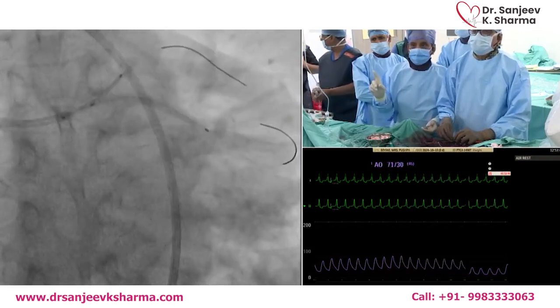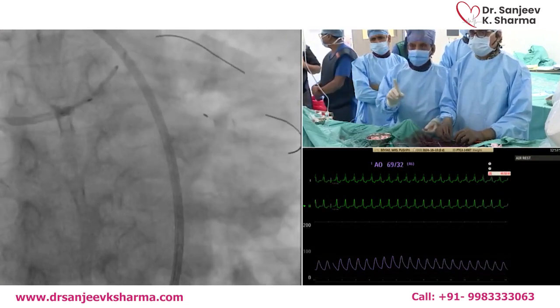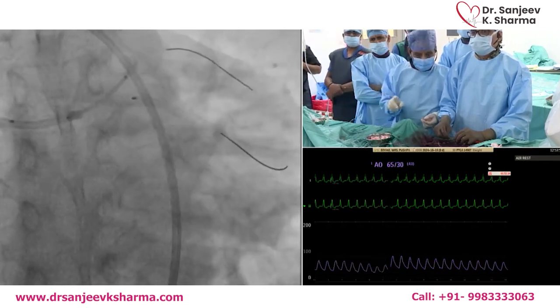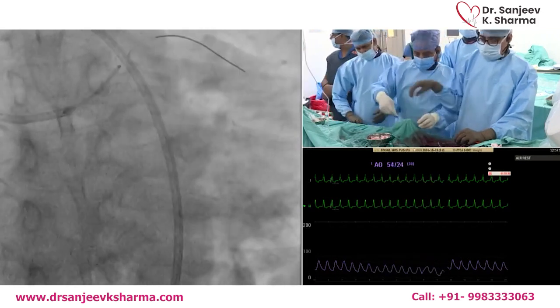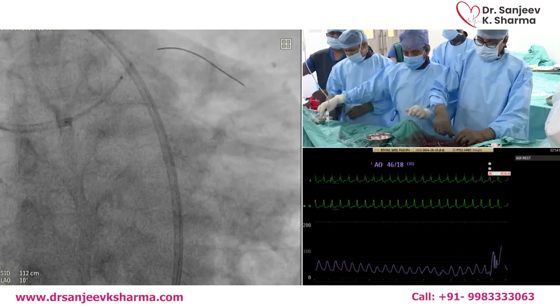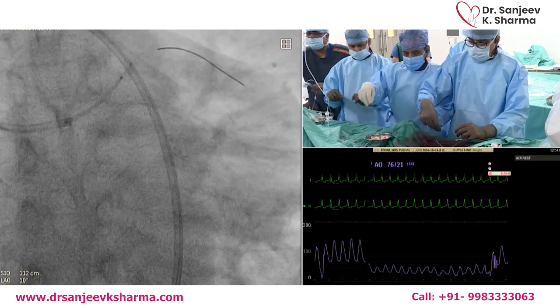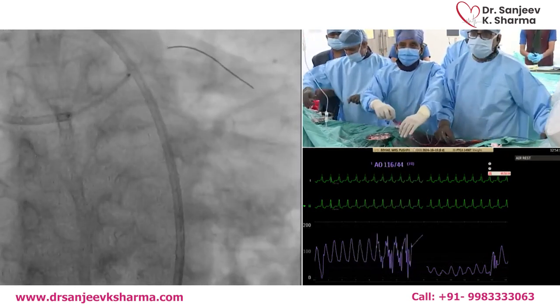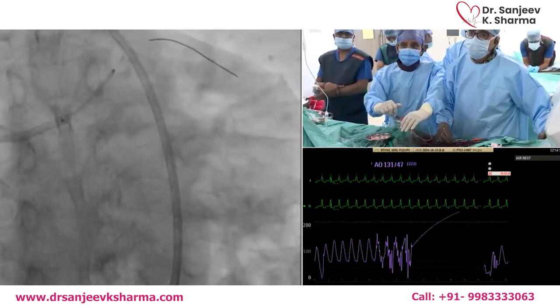Okay, now you have to take both the wires out, as our bifurcation approach has shown. Some people do leave the wire, but there will be one day you will cut the wire. So now take both wires out. Then you need to make sure that your LAD, your other stent, has not moved, proximal or distal. Ideally, if you have pressed it, it has not moved. If it moved, it means that you did not come with the side branch up to the ostium.